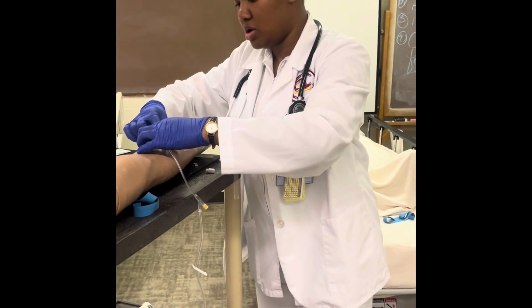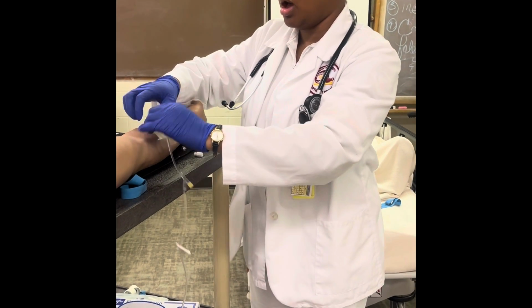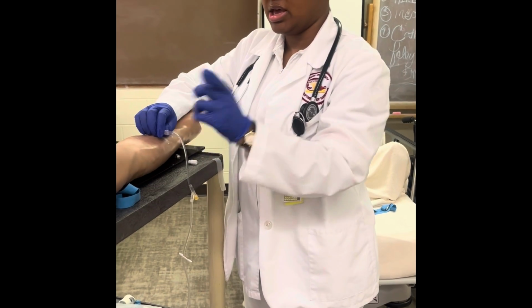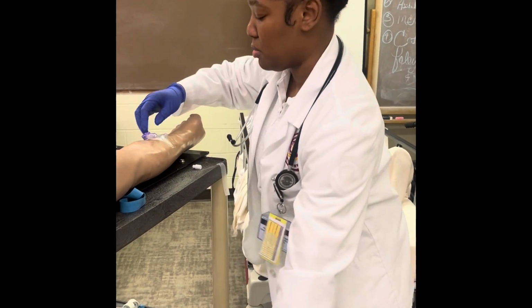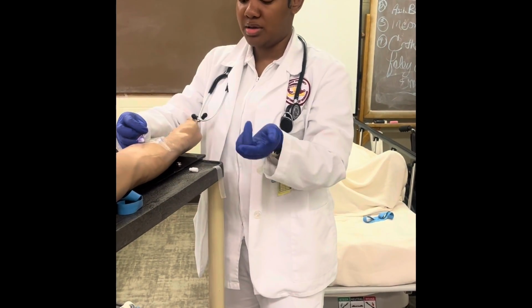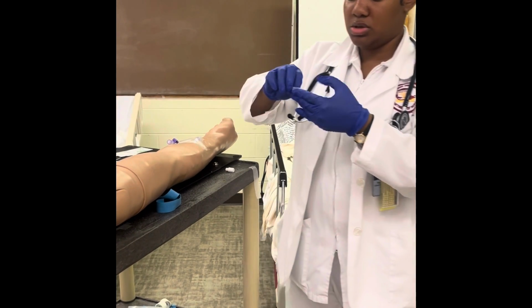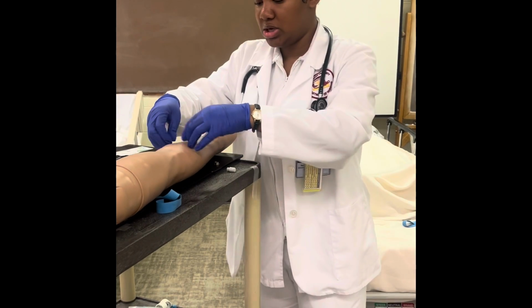So I'm gonna go slow and try to be gentle. Before I would have put the alcohol in there, I would have turned off my pump and unhooked my tubing. Now, I already loosened it up with alcohol, and now I'm taking the tape off. Be gentle, you don't wanna pull on the needle and hurt the patient.